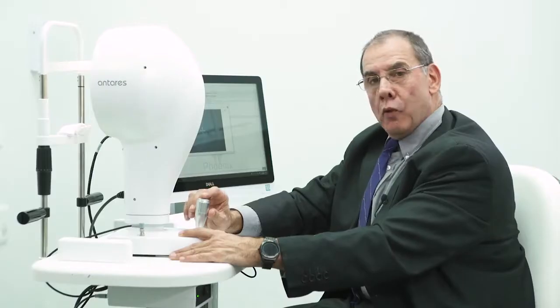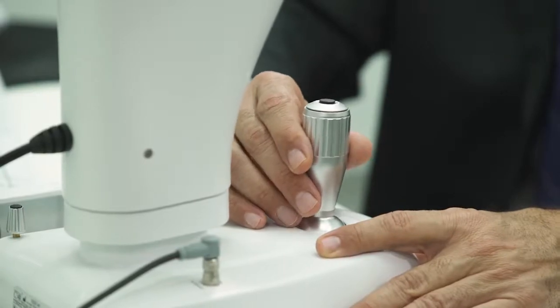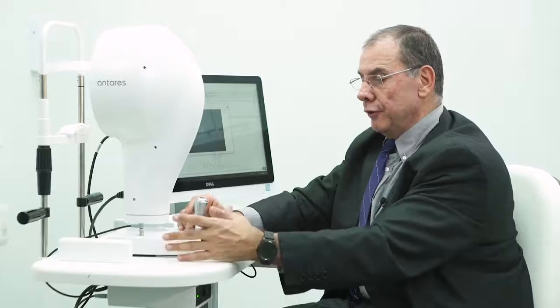We're going to click once on the joystick, and then we're going to move forward, and we're going to try to move forward without going sideways. If you look, I use one hand over here as a stabilizer, and the other hand is on the joystick. I always try to have the joystick as straight as possible, as this gives us a straight trajectory. We won't go and do any slaloming. We're not on the ski slopes at the moment.